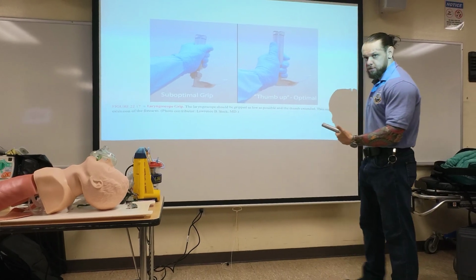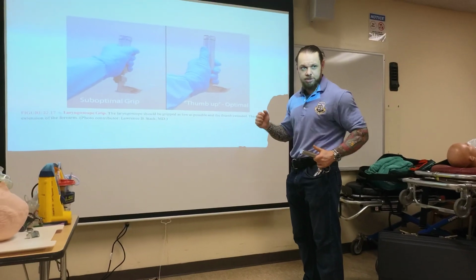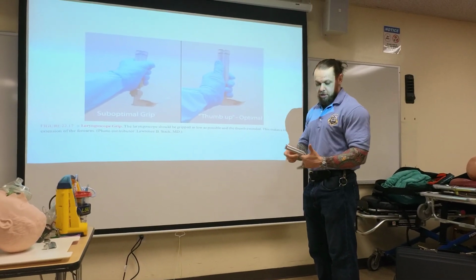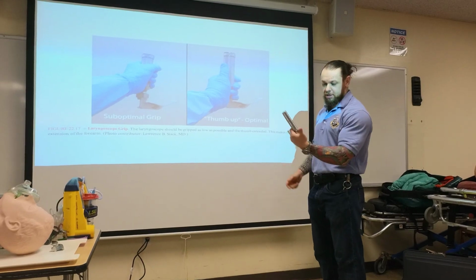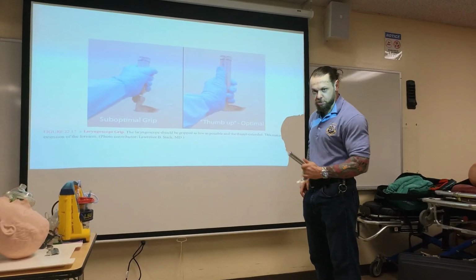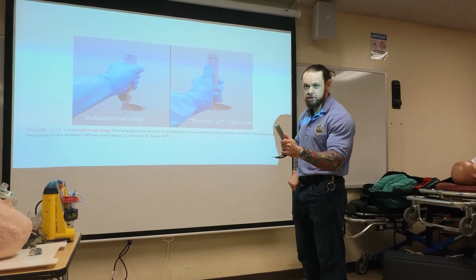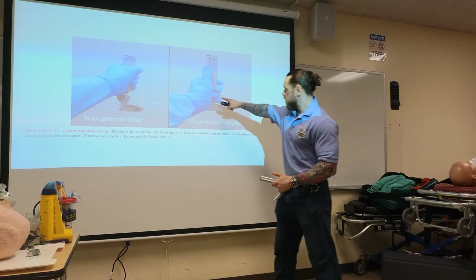You're going to be lower down, thumbs up. Are you old enough to remember the Rock'em Sock'em robots? You remember that, right? So lower down on this, thumbs up, and your motion is going to be like that Rock'em Sock'em motion. Your wrist stays in place. So lower down, thumbs up.